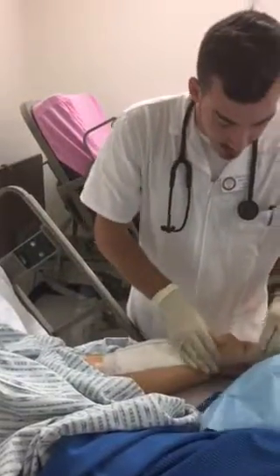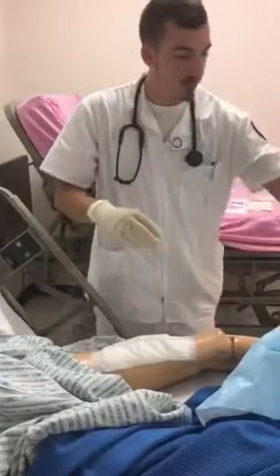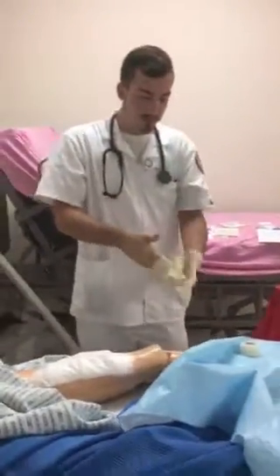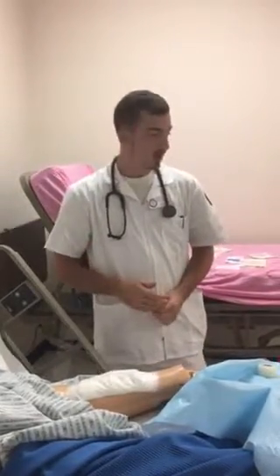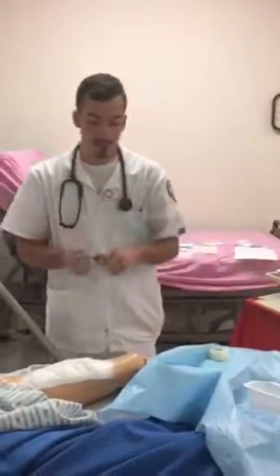And now that my new dressing is well secured, I can go ahead and remove my gloves at this point. And I would go on to document how the patient tolerated the procedure. I would document the time and date of the dressing change, the materials that I used, and I would also come behind myself and initial on the dressing and the date that it was placed.